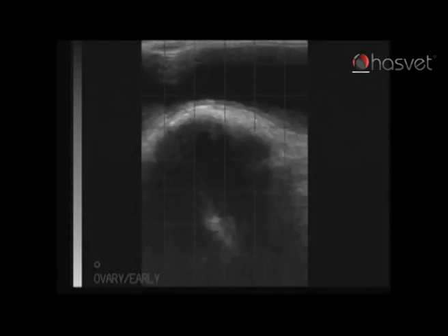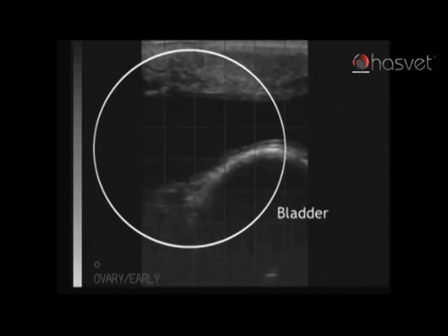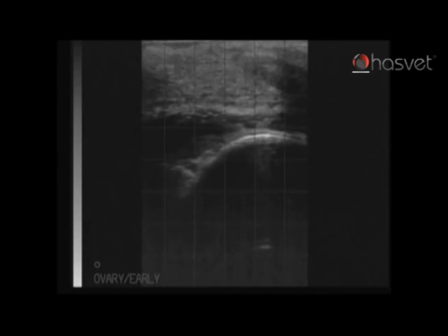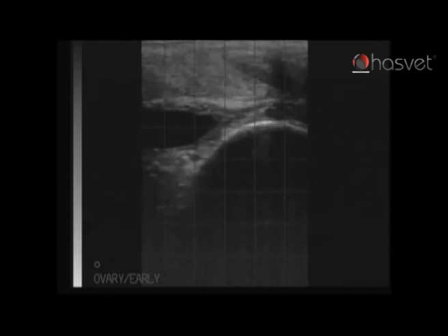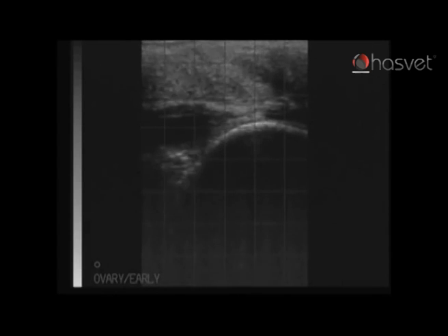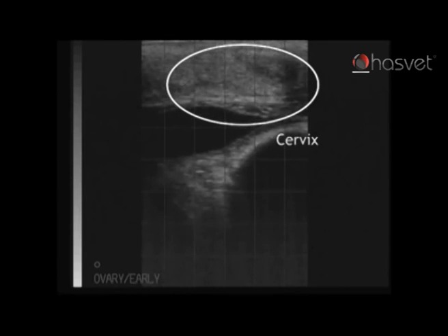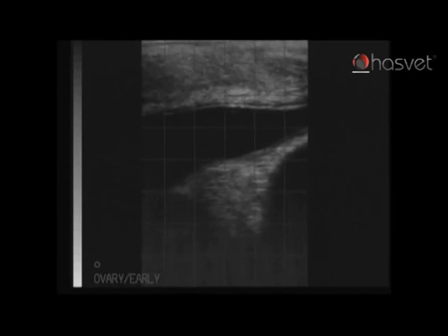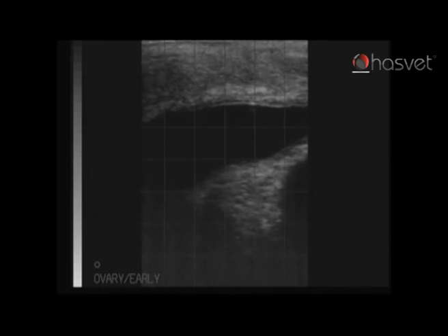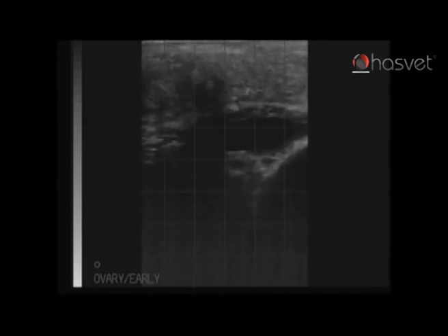Currently we are viewing the urinary bladder of the cow. This should not be confused for the presence of a pregnancy or fluid-filled uterine horns. What we can see at the very top of the screen is the cervical region, a tubular structure which is soft tissue and hence the gray appearance on the ultrasound image.